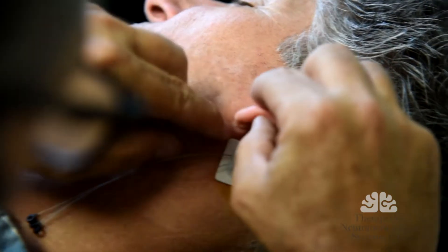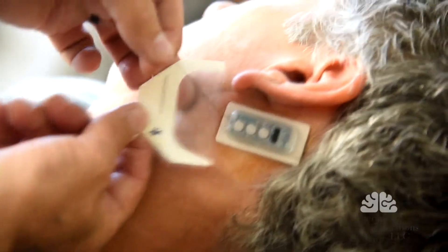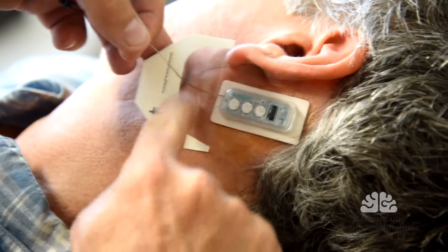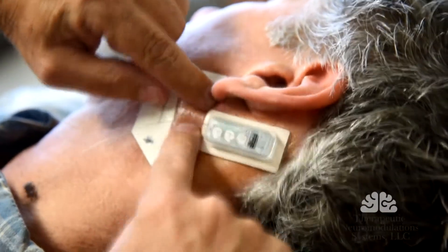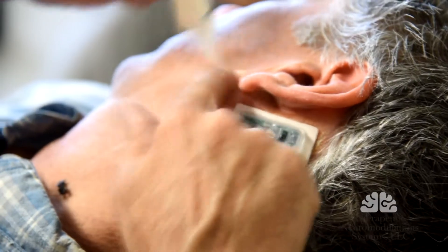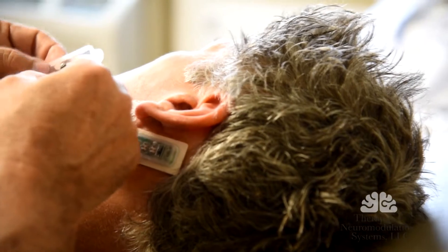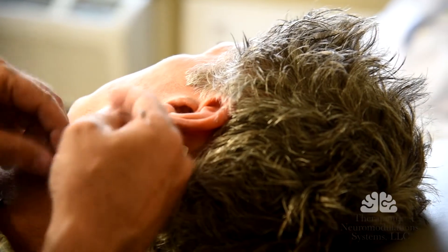I'm going to place it right in the center of it, and it's installed on the ground. Now I'm going to take the ground and ground it. I isolated the ground to keep it separate from the other three leads. I'm going to pull it in, and look into the next one, and insert a needle.